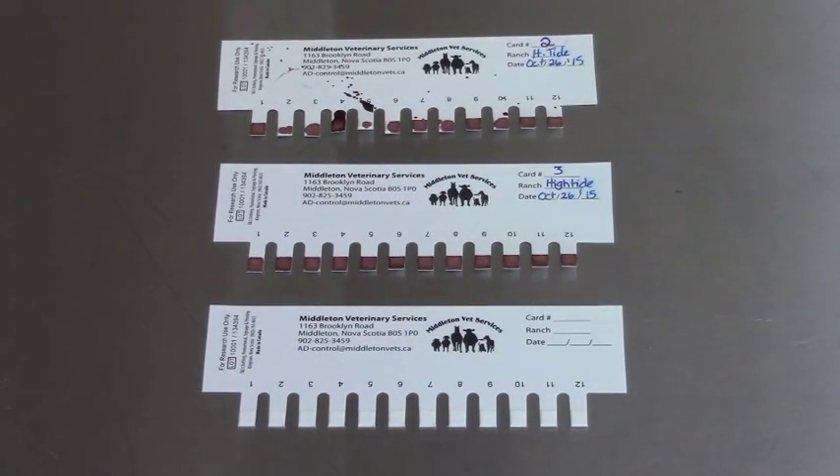These are the combs that we use. They're referred to as combs because of their natural shape. Each one will handle 12 blood samples, and we started at the very beginning working with the mink ranchers to find a nicer way to do blood sampling than the previous methods. The one on the bottom is a blank comb — there are little pieces of blotter paper on it, special blotter paper that antibodies don't stick to but the blood clots on.